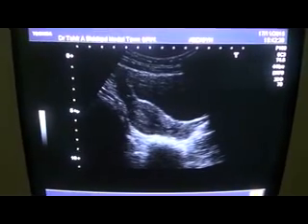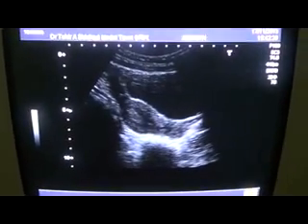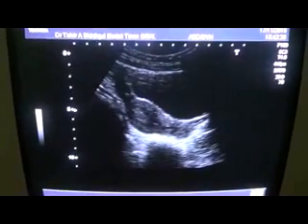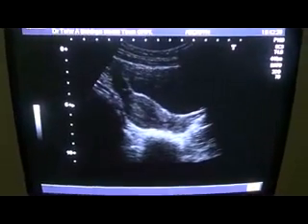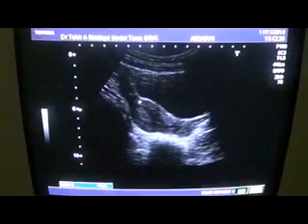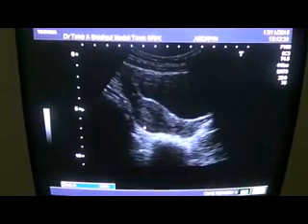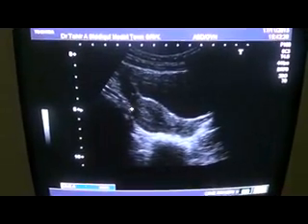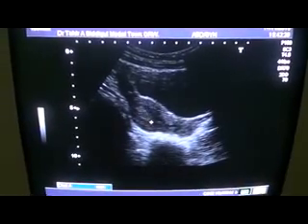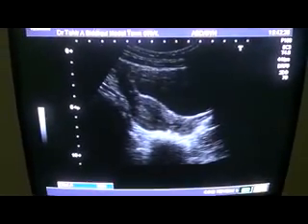This is a frozen section of normal pelvis of a young female, and this is the uterus in a coronal section. This is the fundus of the uterus. This is the endometrial canal and this is the cervix.